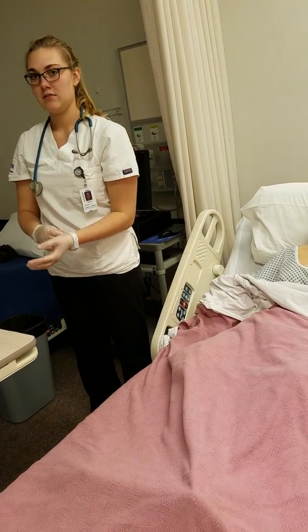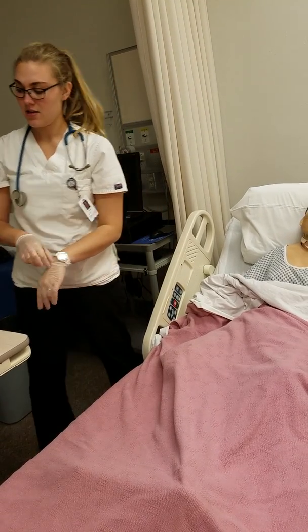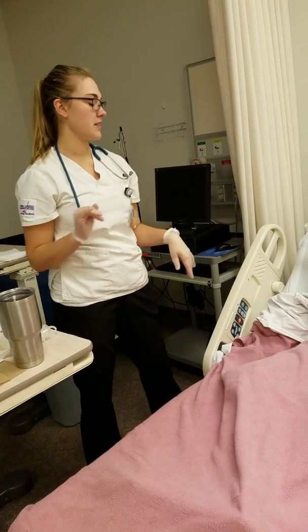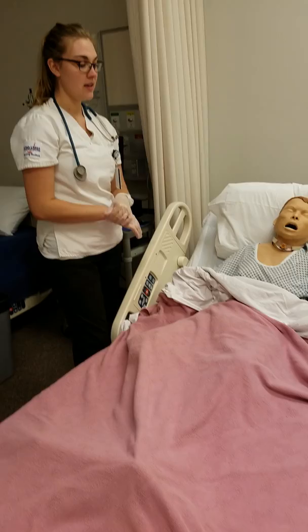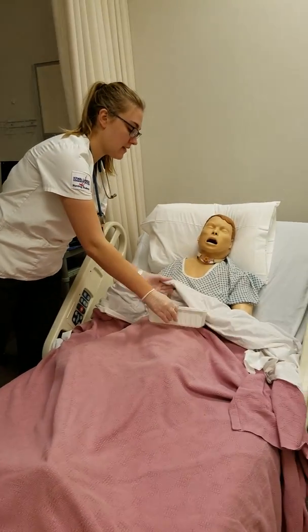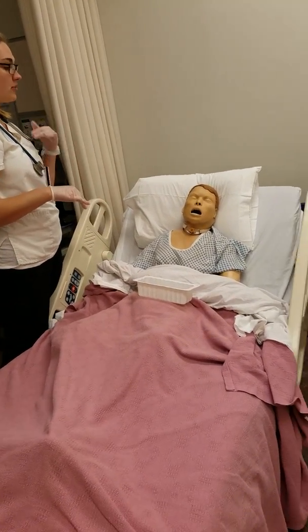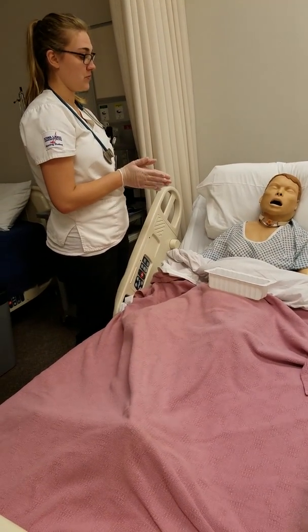Now I'm going to explain the procedure to you, Mr. Smith. Even though you've had one before, I just want to run through it with you. I'm going to be placing this tube. It's going to go down your nose, through your throat, and into your stomach. And if you at all feel like you need to throw up, I will have an emesis basin placed right here for that. I'm going to be giving you water, and as you sip the water, every time you swallow, I'll be placing it further. It might be a little bit uncomfortable, just so you're aware.